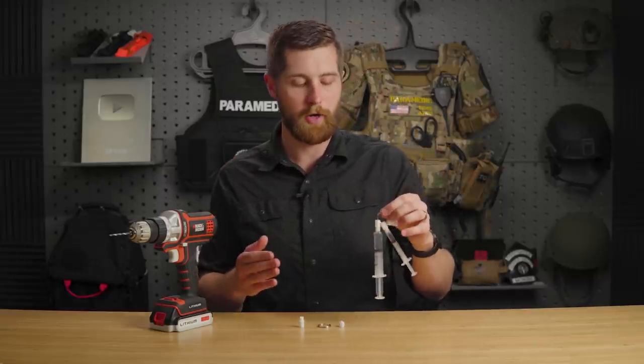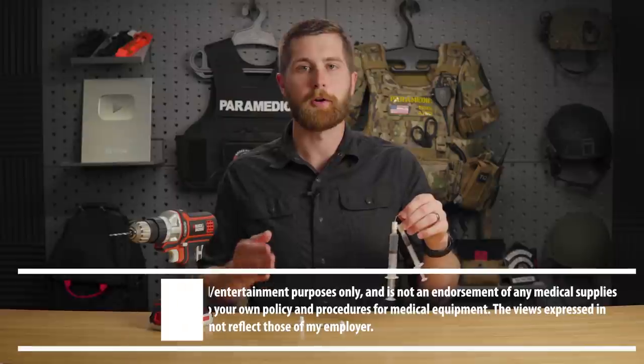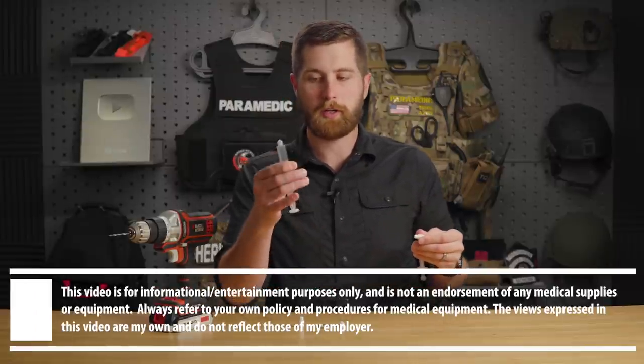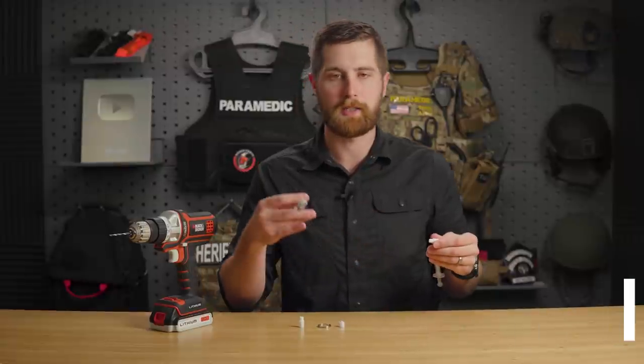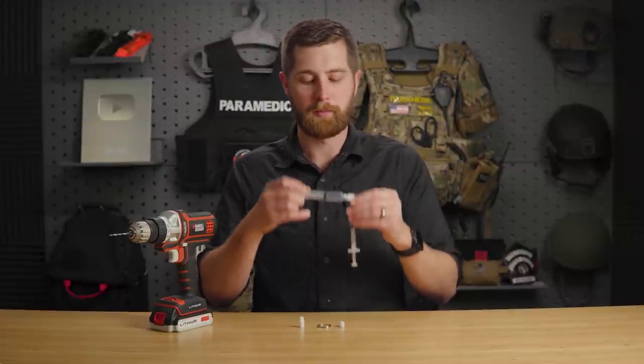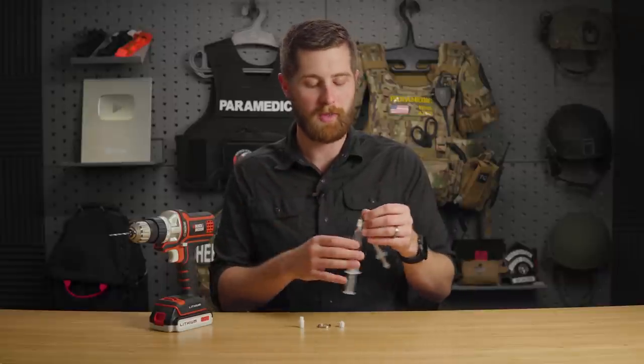A lot of times in EMS and critical care, we have to draw multiple meds that are not always given right away. That means we are oftentimes storing syringes in pockets, placing them on counters, and subsequently losing them or having the plungers push down, losing some of that medication.